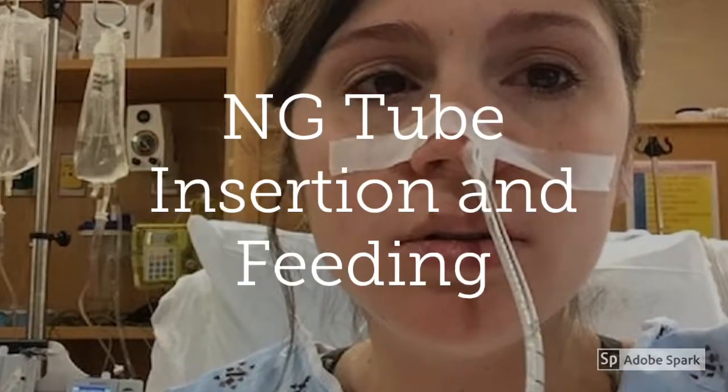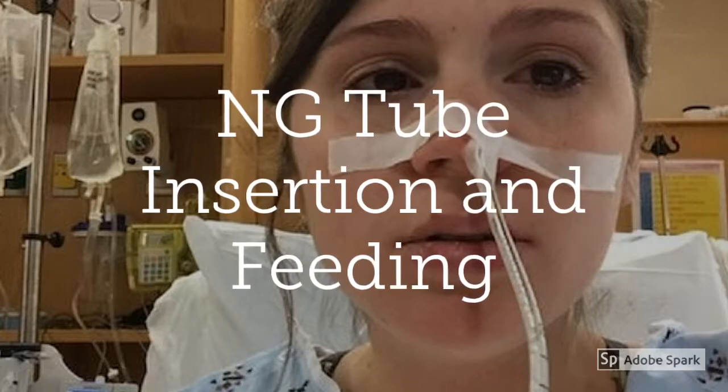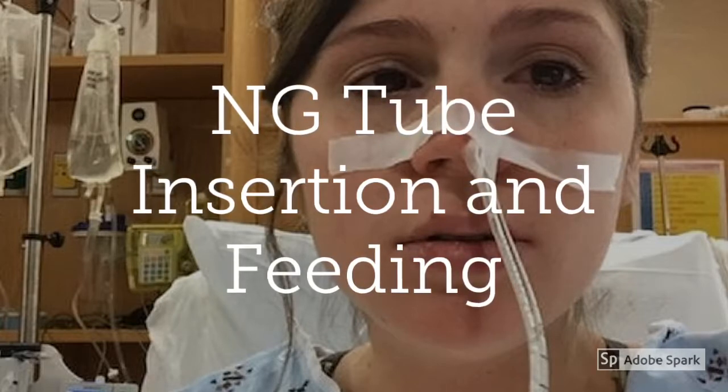Hi, future nurses! We are less than 2 months from graduation, and some of those skills from early on have started to fade. Jamie and I are here to remind you how to insert and use a feeding tube.